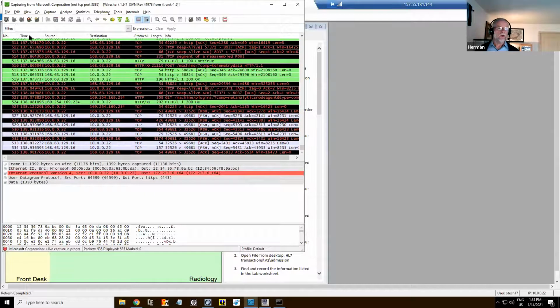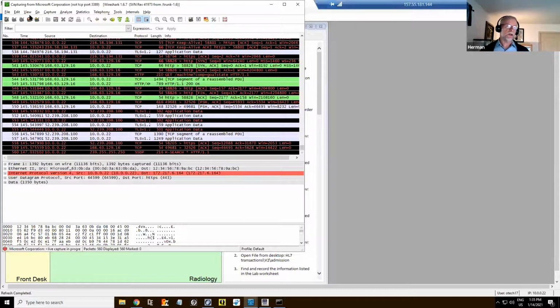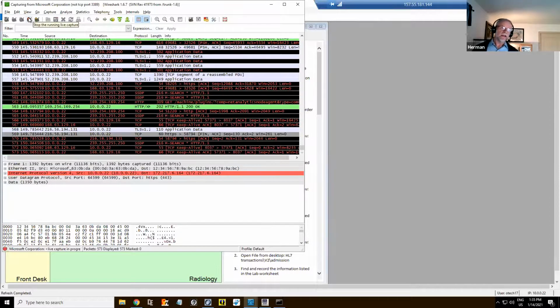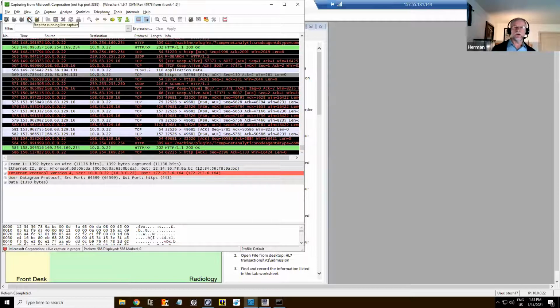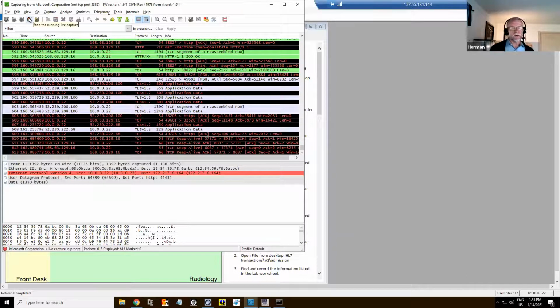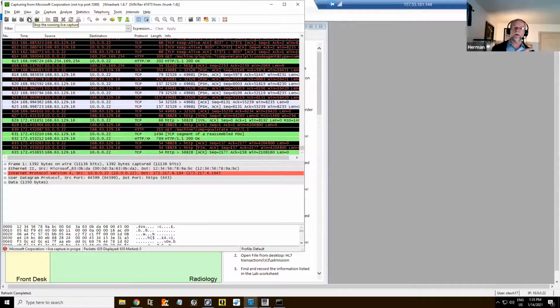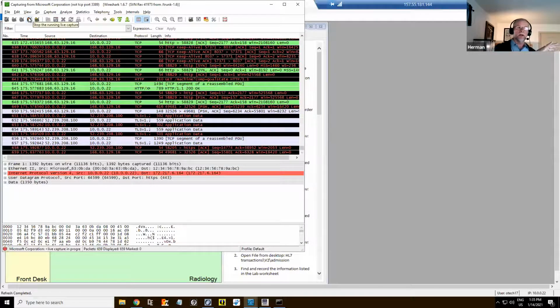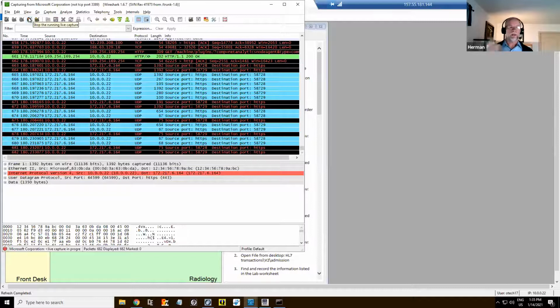One of the things I can do, I could stop it if I want to. I'll probably leave it running because I might do some more captures later on. But if you want to stop it, you can go to the top. It's really kind of cool because when you stop and you enter a new association or a new connection, you want to do a new capture, you can save the capture file. So one of the things I strongly recommend is that you do some experiments and save the capture file, because as you will see, it's not that easy to look at these capture files. So the best thing, if you look at a problem file, is to have something as a reference that is kind of a gold standard. So this is what works. This is how it shows when it works. And this is how it shows when it doesn't work. Okay, here's what happens, right?